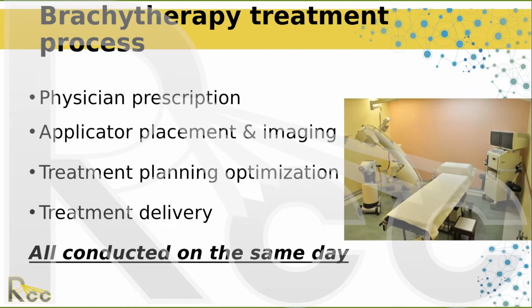As we know, some things are planned once and then treated several times through a course. But I'll get into this. The big thing is once you've got that applicator in there, you don't want to move the patient too much.